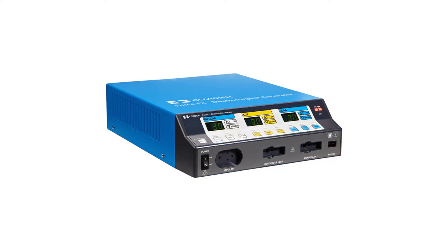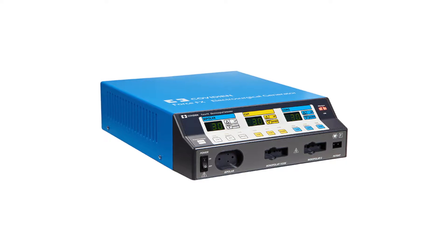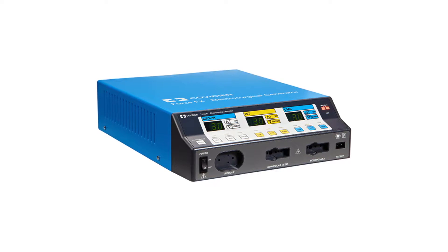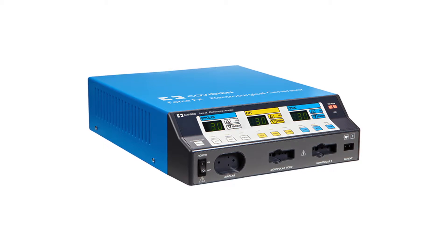The Valilab Force FX is a digital electrosurgical unit. The FX generator features computer-controlled instant response technology, designed to ensure consistency through all tissue types.